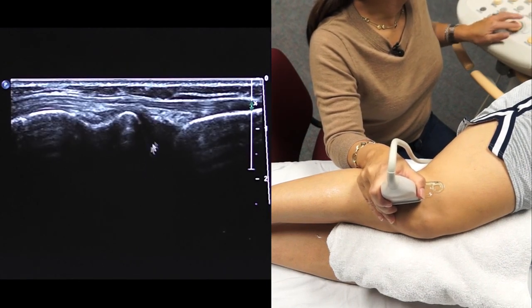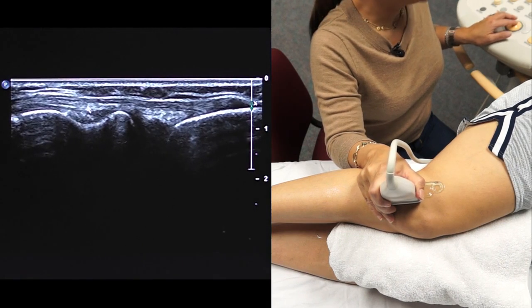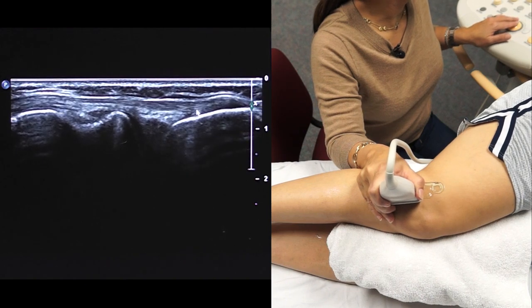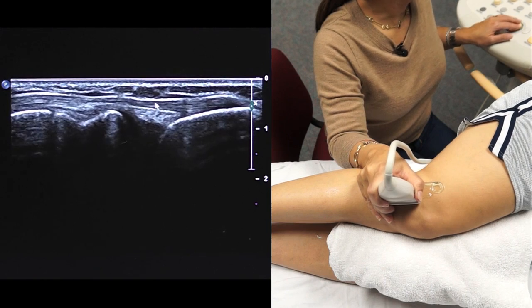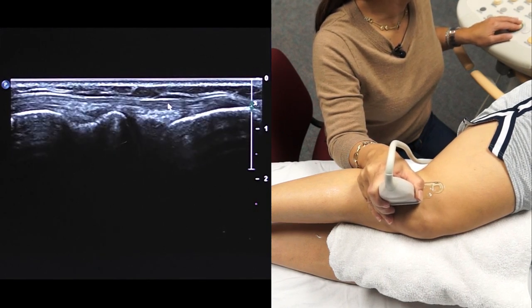Now you can see the iliotibial band extending down over the distal femur and inserting onto the tibia, and it fans out a little bit at its insertion. You can see it has that linear, compact architecture that you expect to see with tendons.